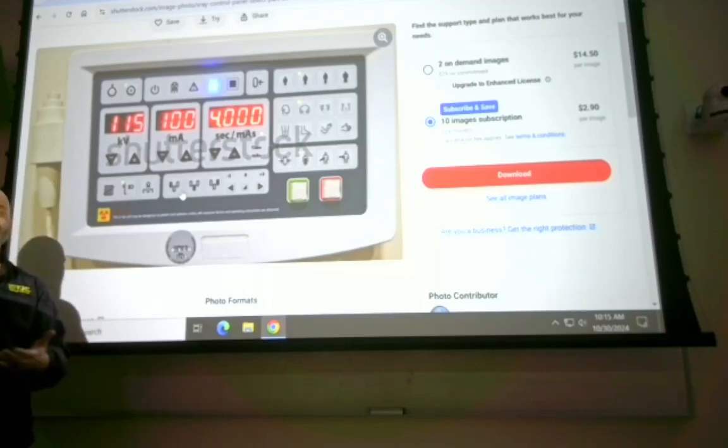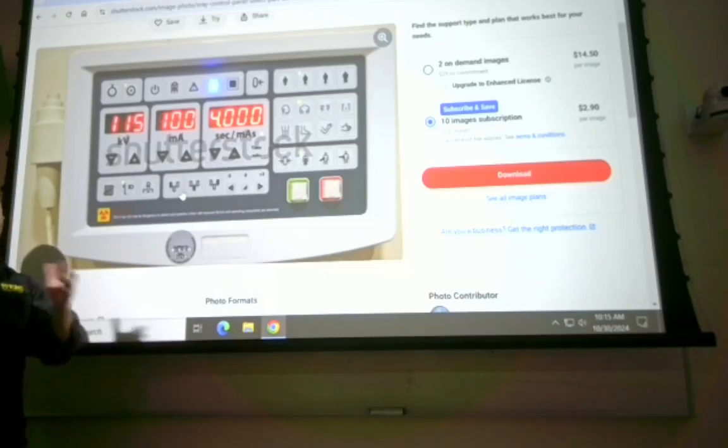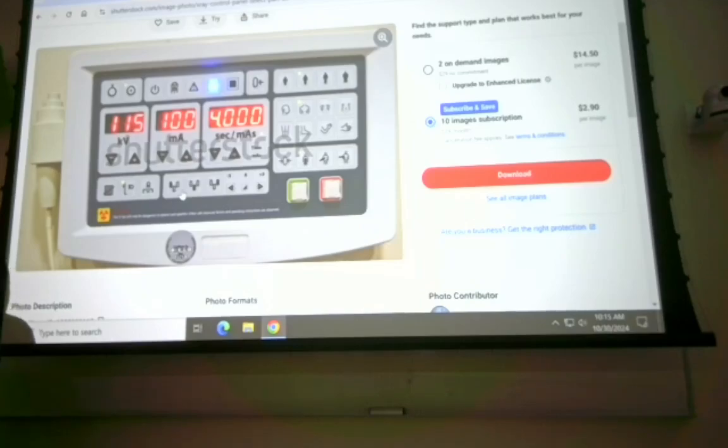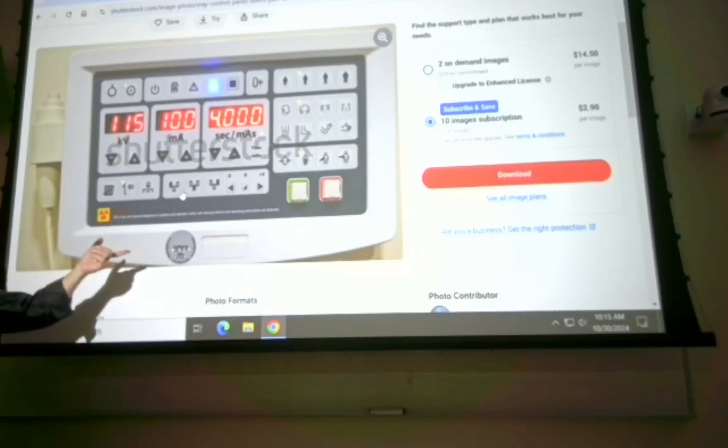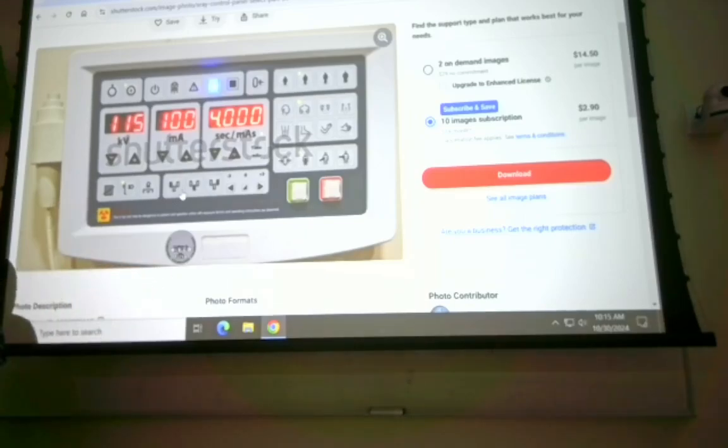So as a result, we don't expect a tremendous amount on your first checkoff. Is the anatomy on there, and is it rotated? Do you have everything there? But what's your second level? You've got to pay attention to what it shoots, and you've got to document that, right? You might not have looked forward to the third level yet, but what do you suppose you've got to do? Set your technique, right?